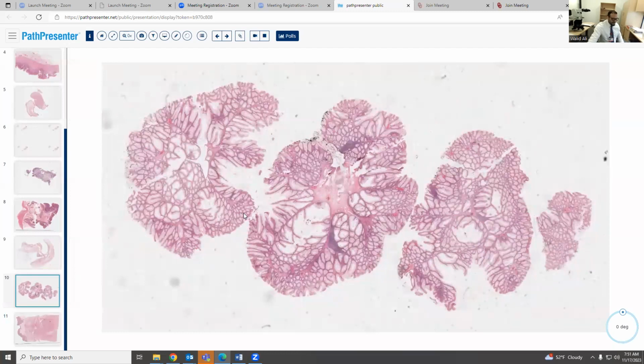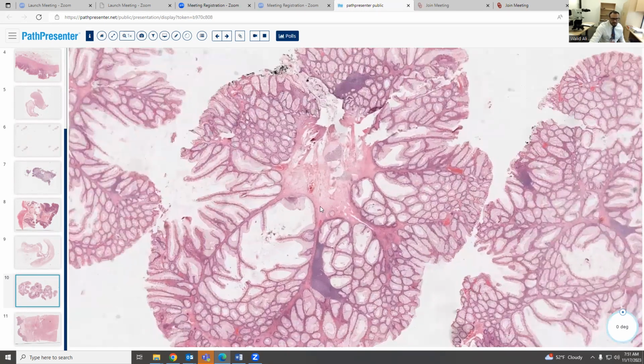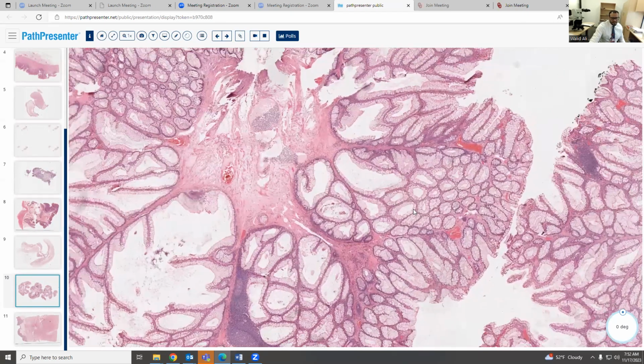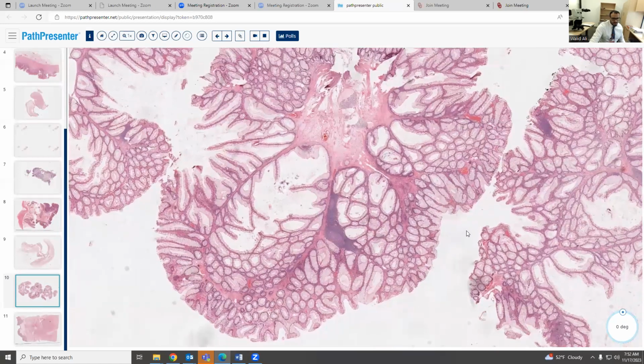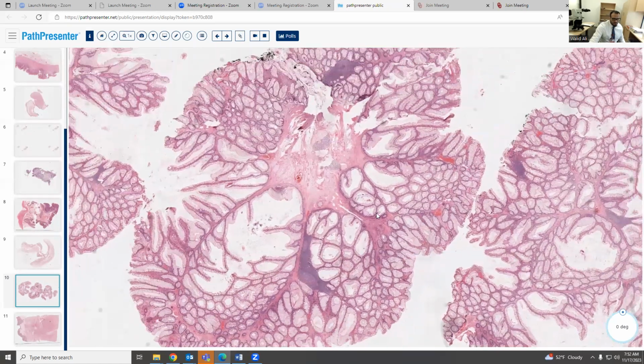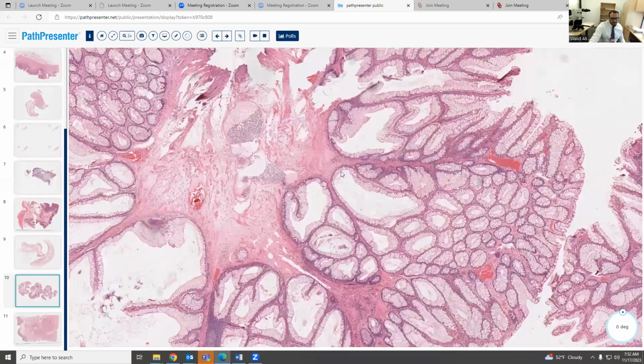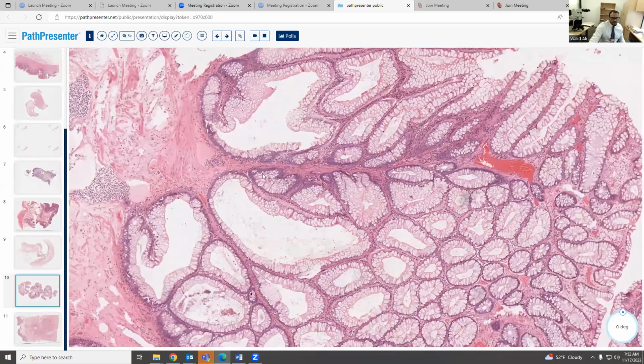And then this is another type of polyp, in the small bowel. We see it a lot at low power. There's arborizing of the smooth muscle, or tree-like growth of the smooth muscle here. And then we see abundant hyperplastic glands, and that's called a Peutz-Jeghers polyp. It's also important to know about, with very helpful features. We see this tree-like growth, or upward growth, of the smooth muscle. It's tree-like, right? It looks like a tree.